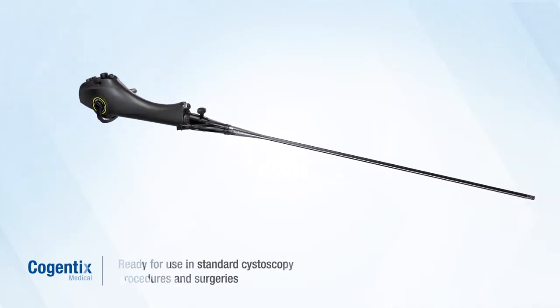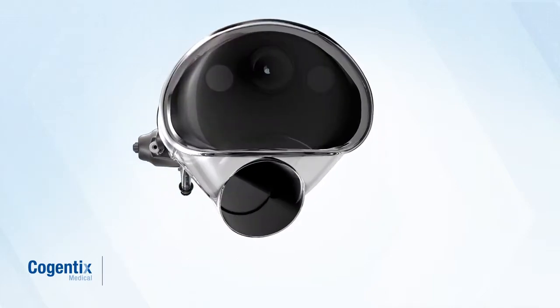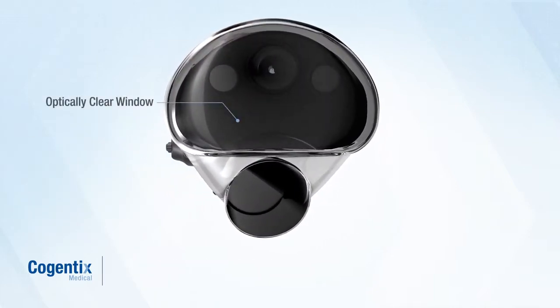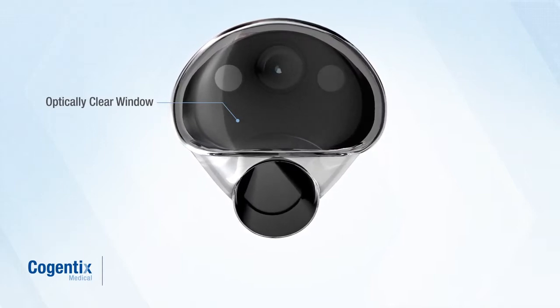After placing the sheath on the scope, it is ready for use in standard cystoscopy procedures and surgeries. The optically clear window at the tip of the sheath provides excellent visualization and does not interfere with imaging quality.